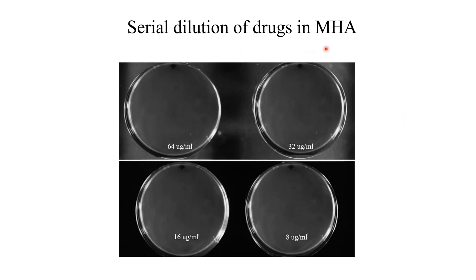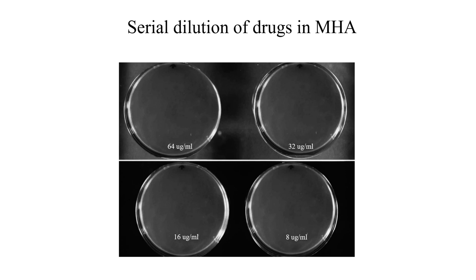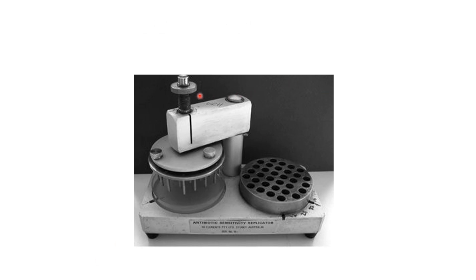The procedure is the same as discussed earlier. First, we make different concentrations of antibiotics in Mueller Hinton agar. Here you can see 64 micrograms per milliliter, 32, 16, and 8 micrograms per milliliter antibiotic concentrations in separate Mueller Hinton agar plates.